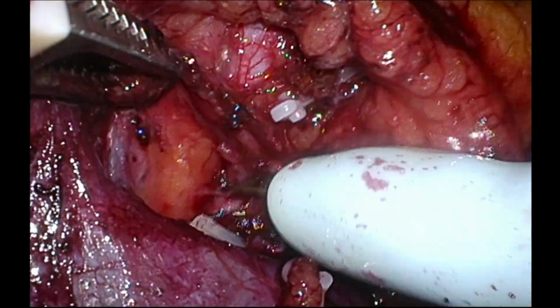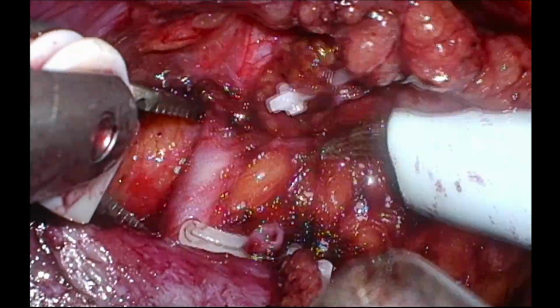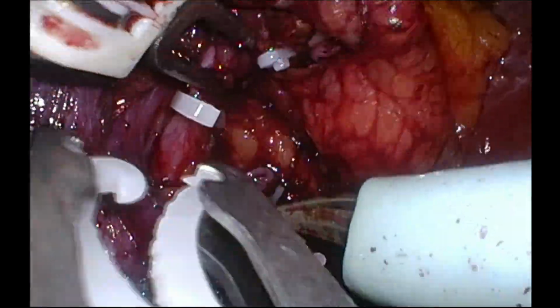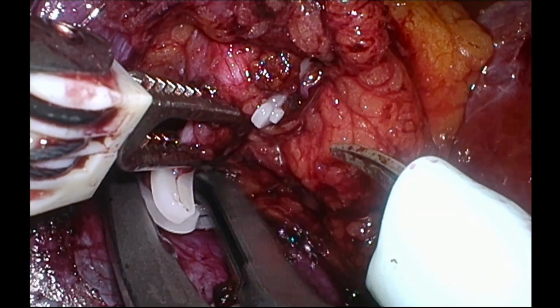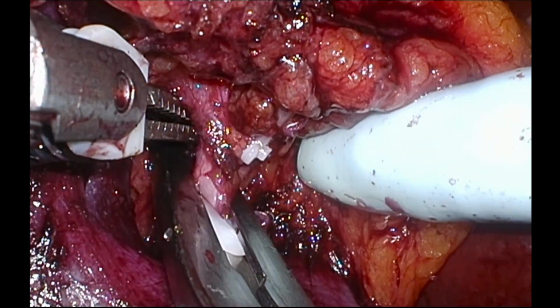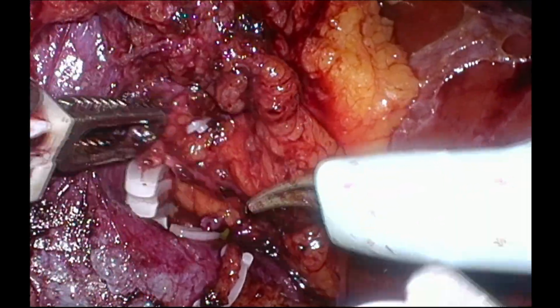Renal artery cranial to the renal vein is dissected. Window behind the renal artery is created. Hemolock clips are applied to the renal artery. It is our practice to apply 3 clips proximally and 1 clip distally and cut between the proximal and distal clips. One small upper polar branch from this renal artery is clipped separately.